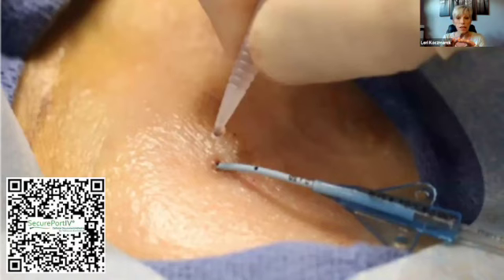What you will see, especially if you add tissue adhesive beyond that insertion site to improve your dressing adherence, is that you're less likely to have repeated trauma to the skin from unscheduled dressing changes. Anecdotally, clinicians report that the dressings stay on, and you're not putting extra tape to hold down the borders or the edges. That traumatizes the skin, because every time you take that off, you're shearing away the epidermis. And if you're maintaining your dressings for those 7 days, that's really critical, not only for the patient but also for letting that site heal and keeping that skin intact.